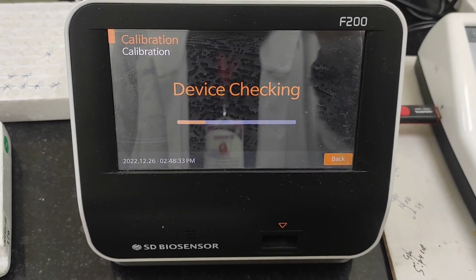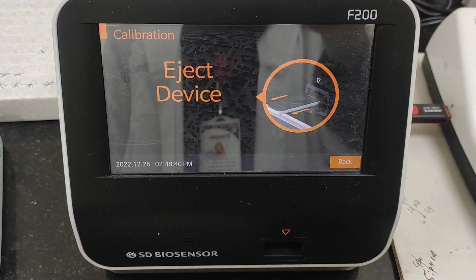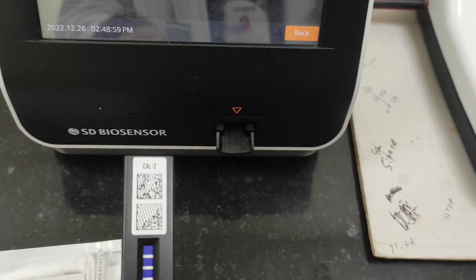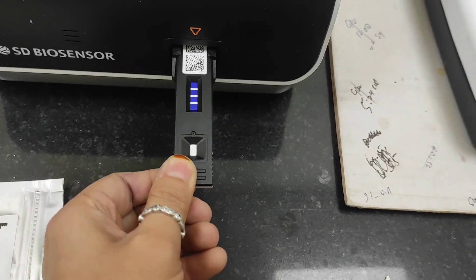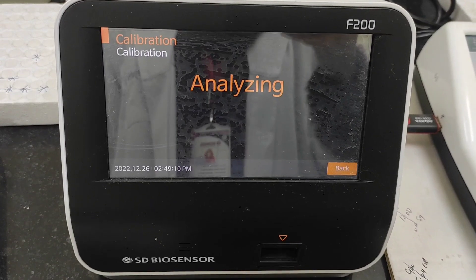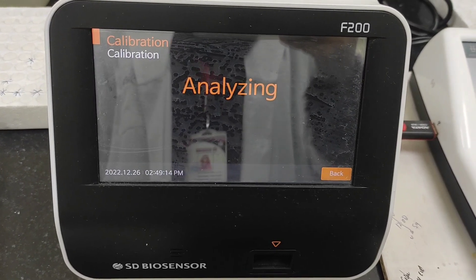The machine is now tracking the device — the card. As I said in my earlier video, there is a barcode on each cartridge. Now I'm inserting the second calibrator cartridge here. The same process is going on; it will check the device and analyze it.